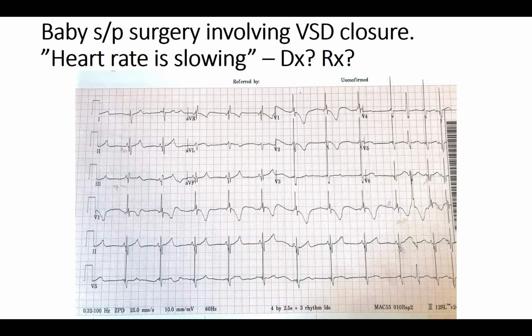Some people would say, if it's coming in and out, and it's stopping the majority of the time and the patient is hemodynamically stable, that's fine too. We see this not uncommonly in healthy children in the well baby nursery. It seems like at least once a month, one of us is asked to review an EKG of somebody who's having atrial bigeminy or a lot of blocked PACs causing a slower ventricular rate, and somebody is concerned about that.